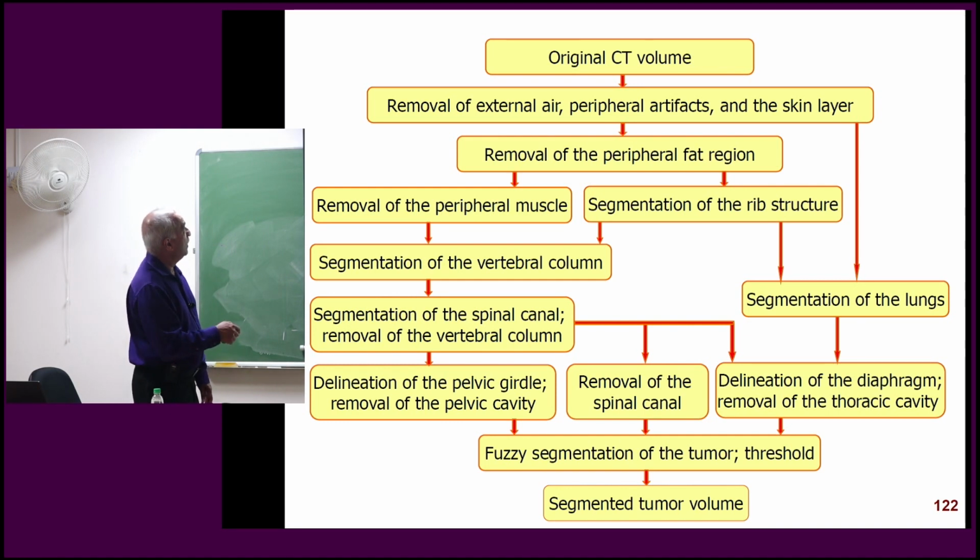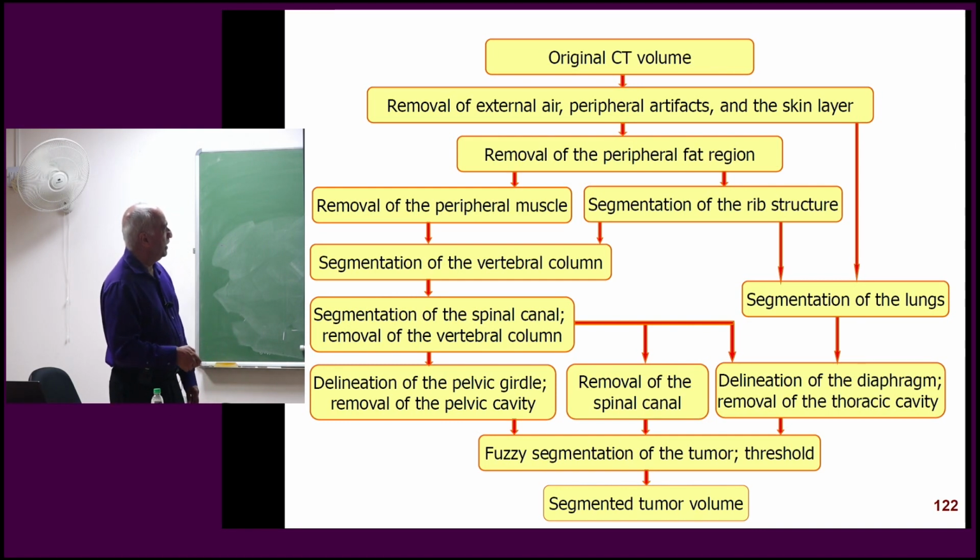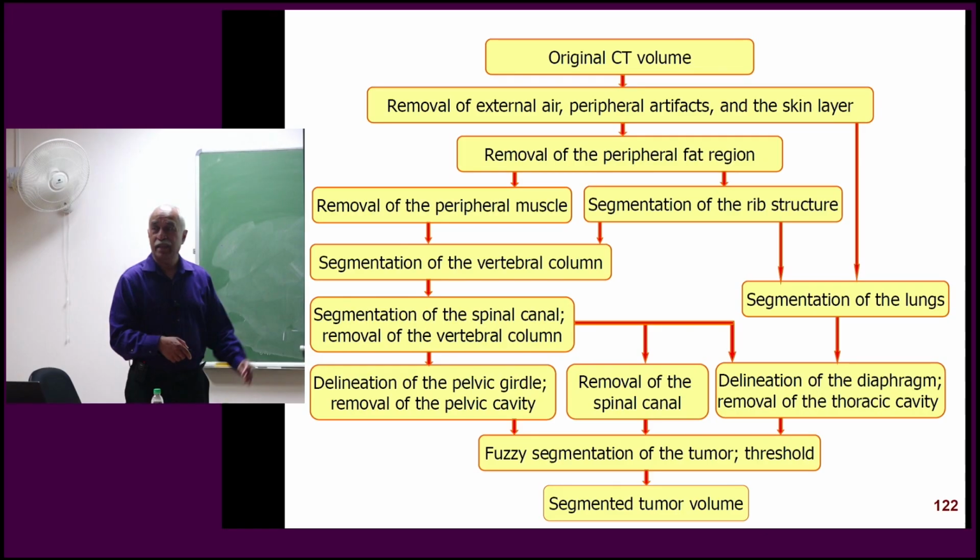of that. So all of these methods I described earlier, the idea was that eventually all of this landmarking and removal of unwanted parts in tumor detection would help in segmentation.